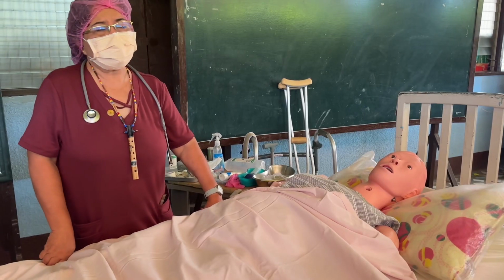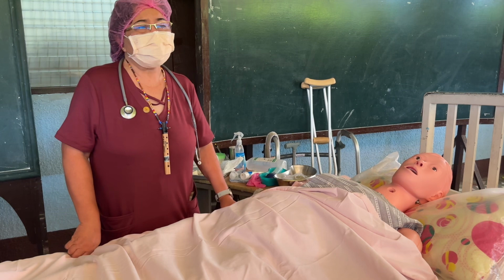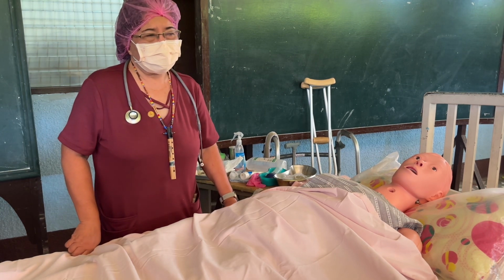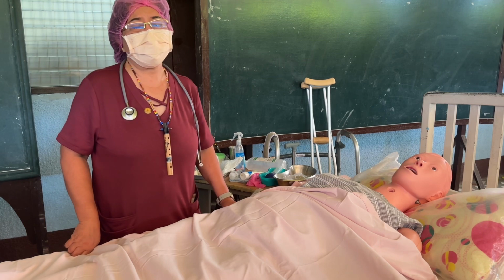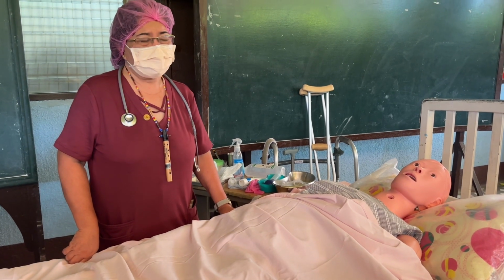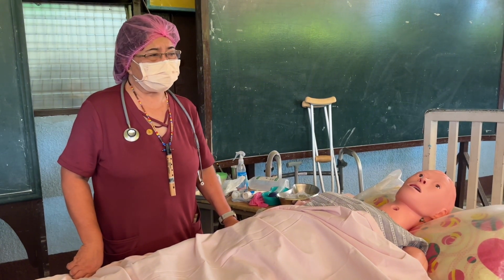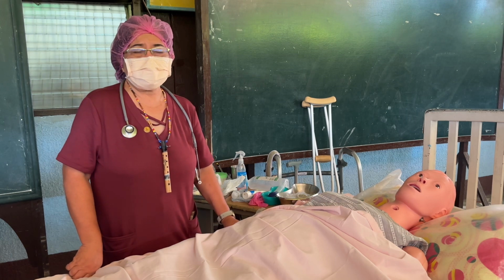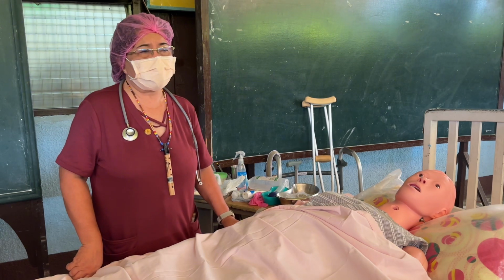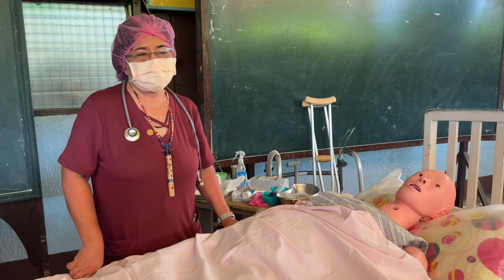At this point, we're going to learn the procedure which we call nasogastric therapy. When we say NGT, it stands for nasogastric tube. When a nasogastric tube is inserted in the patient, the indications are as follows. It is done for cases of gavage, meaning for feeding.